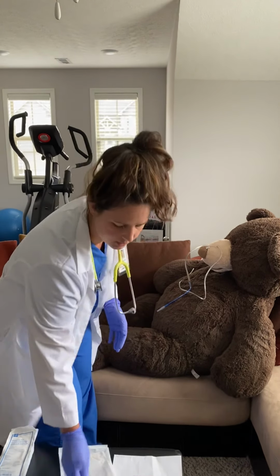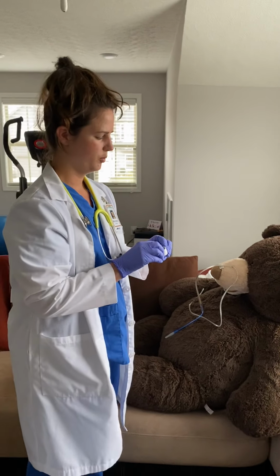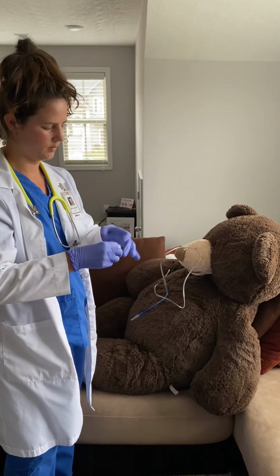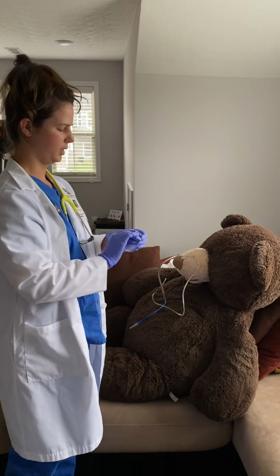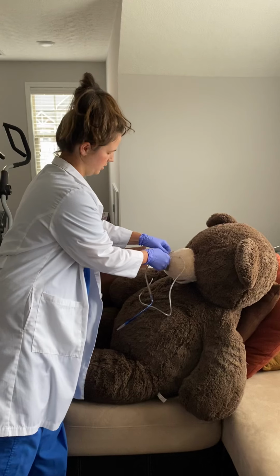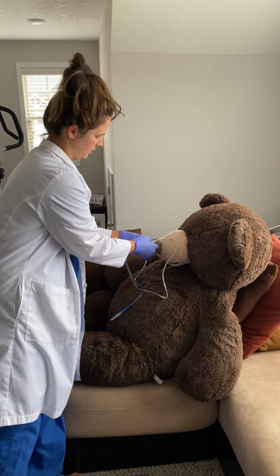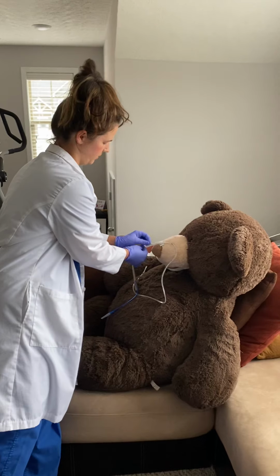Once you've found placement, confirm that, then you're going to take your anchoring tape and some benzoin tincture, put it on the skin and the tube to make sure that the tape will stick. Okay, take your tape, and you're going to split it halfway down. Anchor onto the nose. Then you're going to take the split ends and wrap it around the tube, weaving one way. And then you're going to take the other half, weave it around the other way.